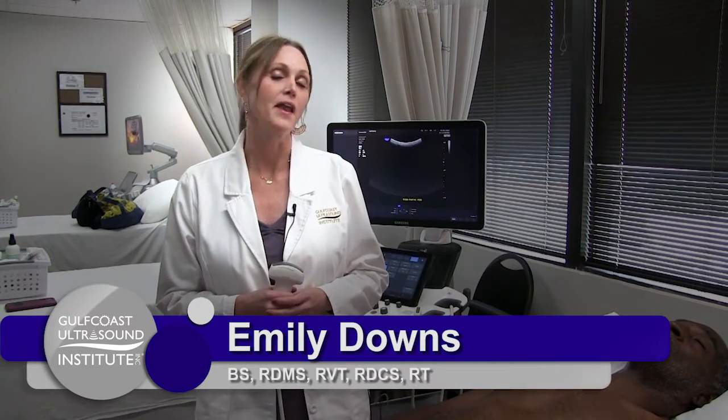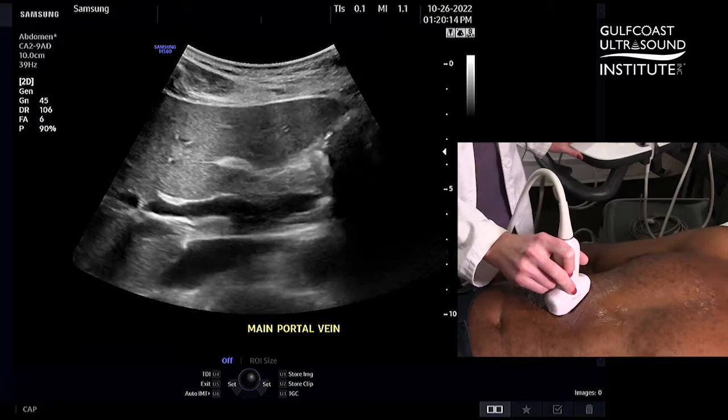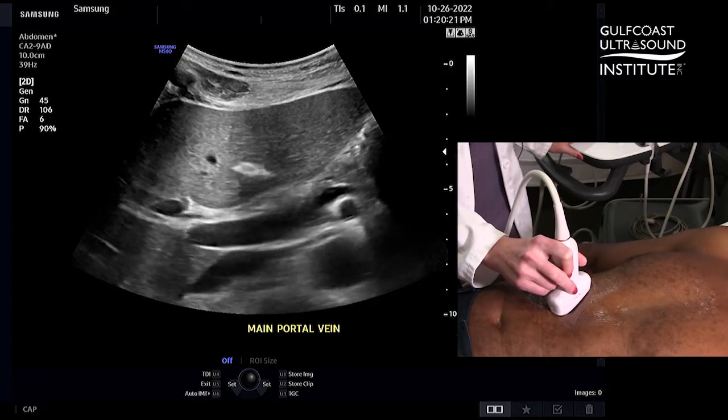Hi, I'm Emily Downs. I'm here at Gulf Coast Ultrasound Institute with your hot tip of the day. We're going to look at the main portal vein and how to get a great pulse wave Doppler. Before we get started, it's important to remember to always get a great 2D picture before turning on color or optimizing your pulse wave.